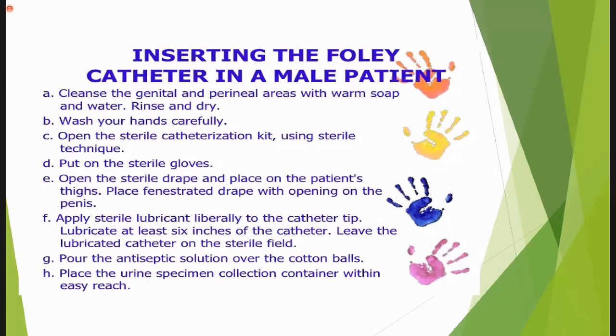Inserting the Foley's catheter in a male patient. Now I will discuss male patient catheterization. First of all, clean the genital and perineal areas with warm soap and water. Then dry the area, wash your hands carefully, and open the sterile catheterization kit using sterile technique.